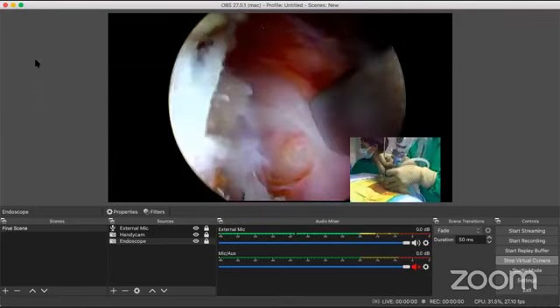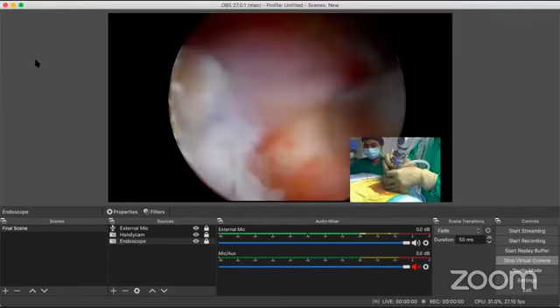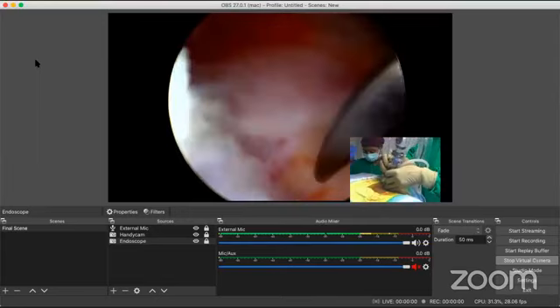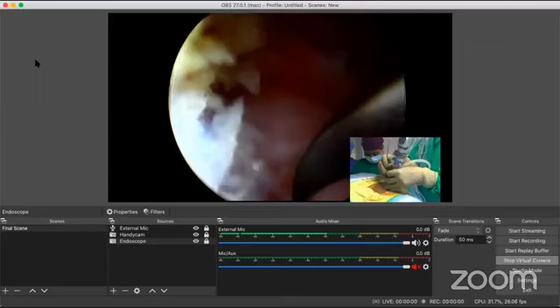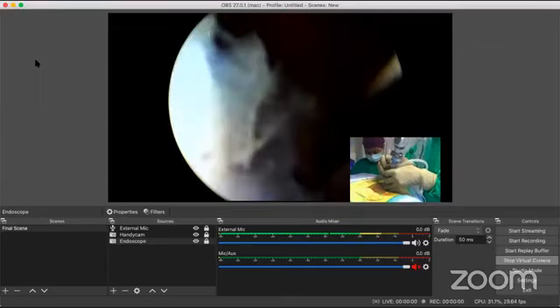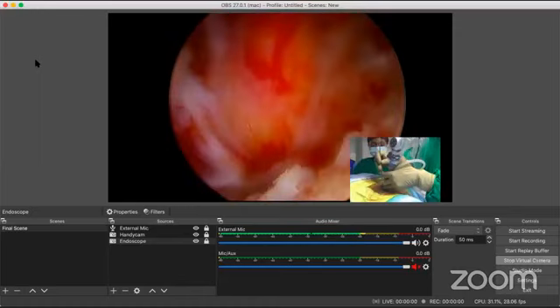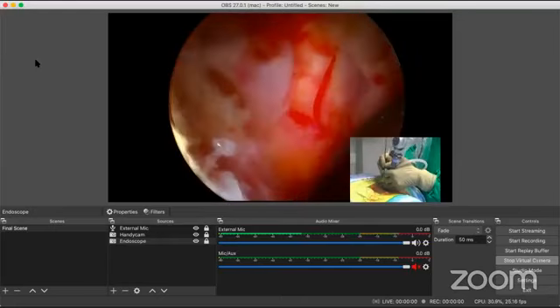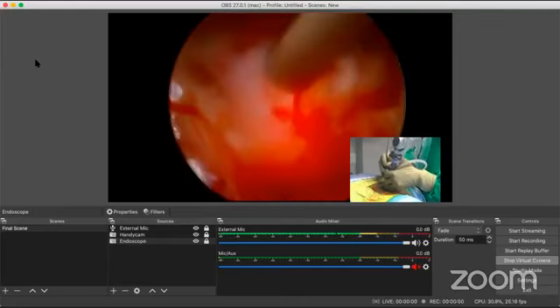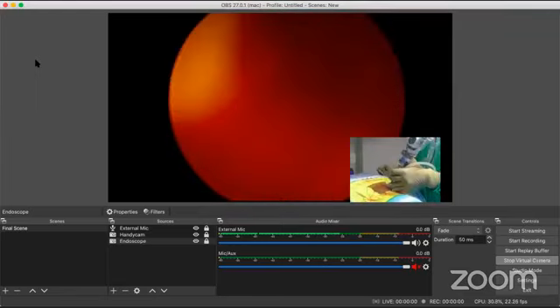I'll just retract all the tissues. See, this is the osteophyte over here. There is no soft disc over here. It's hard. You can see I'm pressing down with all my might. Nothing happens there. There's nothing to go into. And you can see from here that our nerve root is nice and free. We've gone nicely laterally far beyond the osteophyte. So we don't need to destabilize the spine further. This patient should be up and about tomorrow.